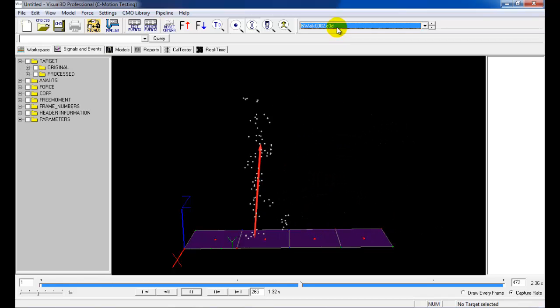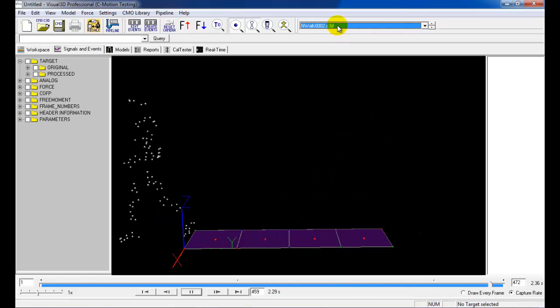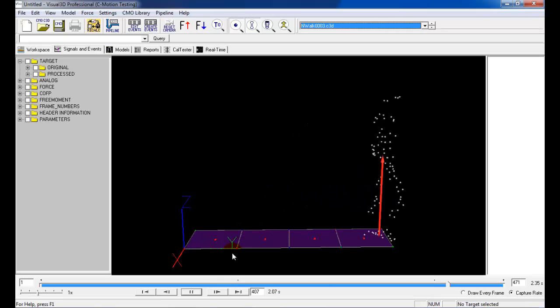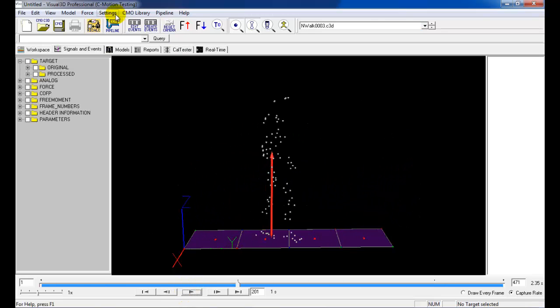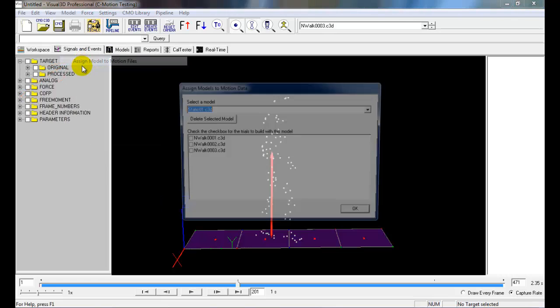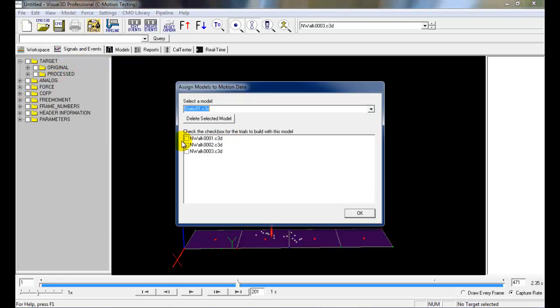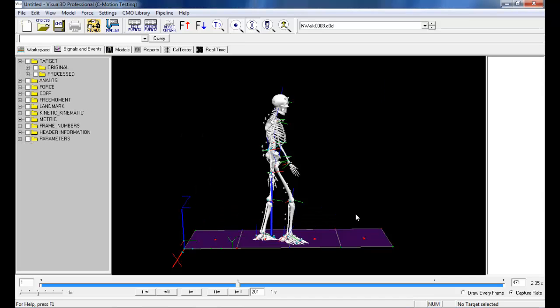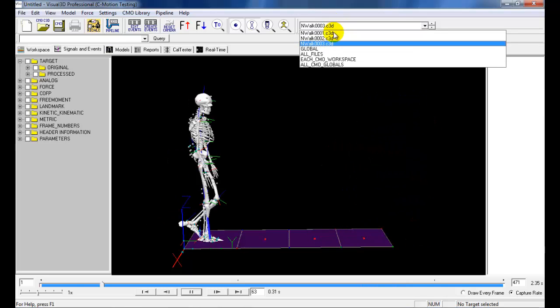In order to compute model-based data, it is necessary to assign the model to the motion files. To do that, select Assign Model to Motion Files found under the Model menu and select the correct motion files to be associated with the model. Multiple movement files can be assigned to a model, but only one model can be assigned to each movement file. Also note that the force plate vector is now blue, indicating that the force is now assigned to a segment.